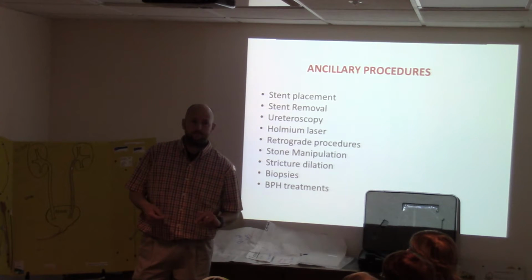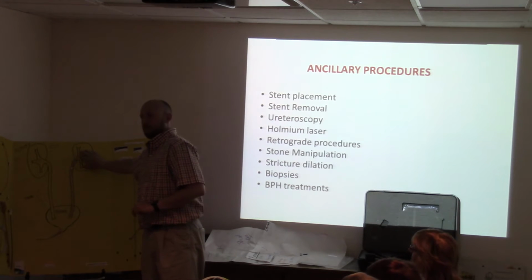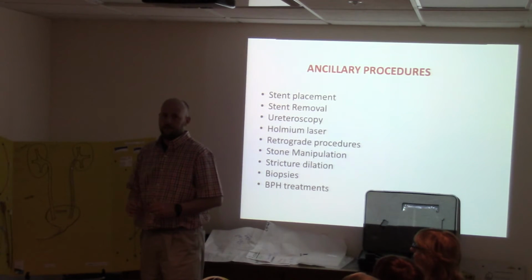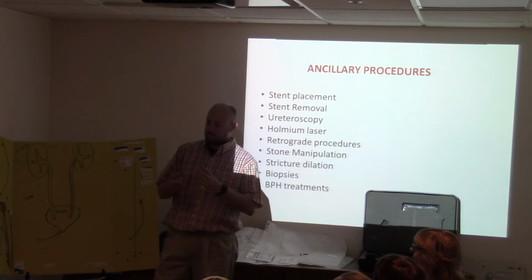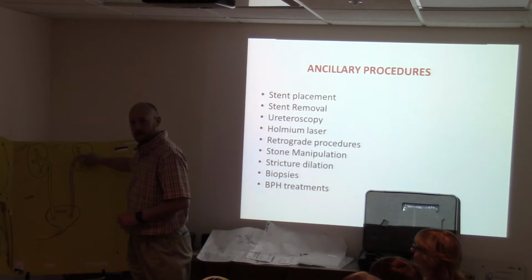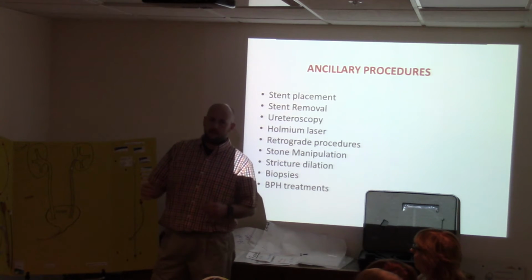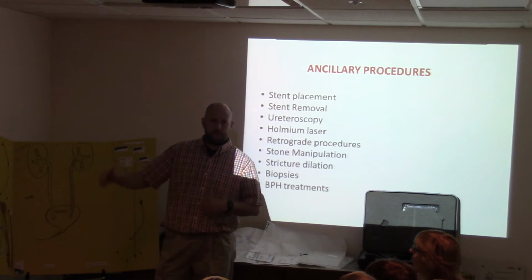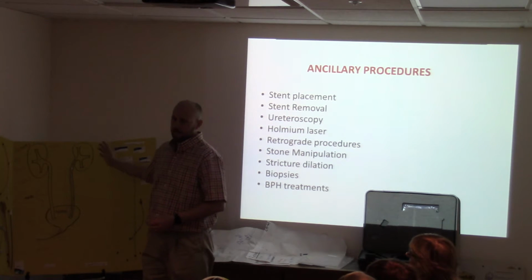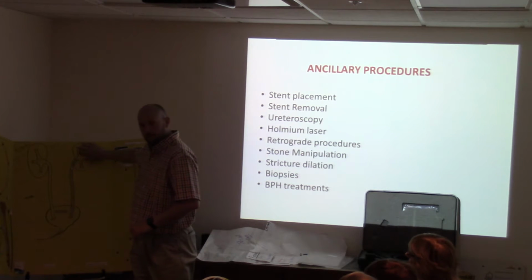And if you, as a tech, bite off more than you can chew, and just center in the middle and hammer it, you have bigger problems, because then there are big pieces of stone everywhere. So you're better off focusing on the UPJ area and treating 3,000 shocks here, because you've got to think long term, big picture. You can't just, you're not going to get it all in one treatment. So you should start small and then work on the upper pole the next time the patient comes.